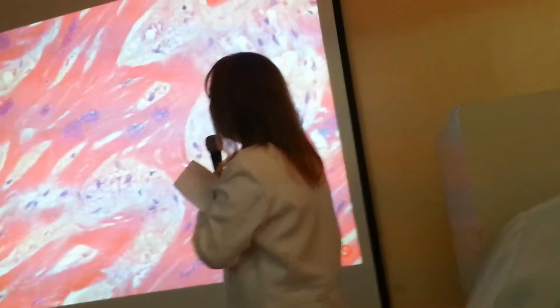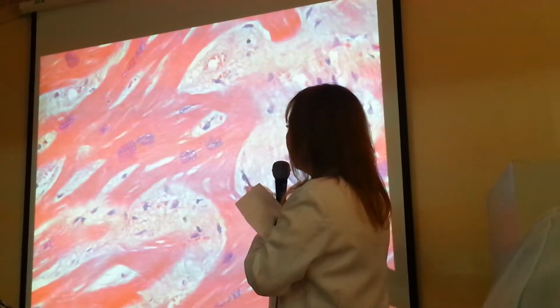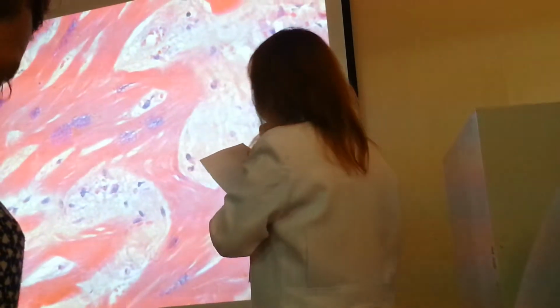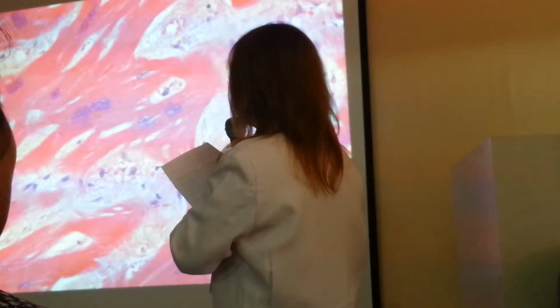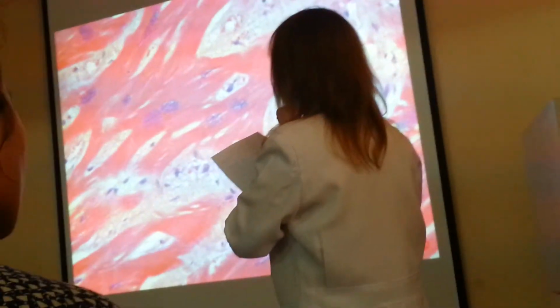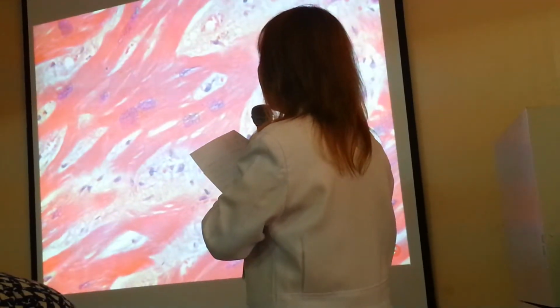And the cross striations that you appreciated, you have seen in the previous slides, you cannot appreciate it here anymore. So these are the myocardial hypertrophy. So basically that's the things you need to take note, that the nuclei is a little bit enlarged, loss of nuclear striations, and the eosinophilic cytoplasm is homogeneous, it's more pinkish, and the cellular details are not as delineated as before.